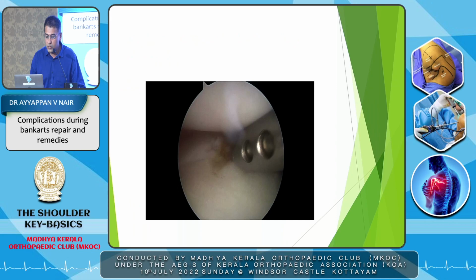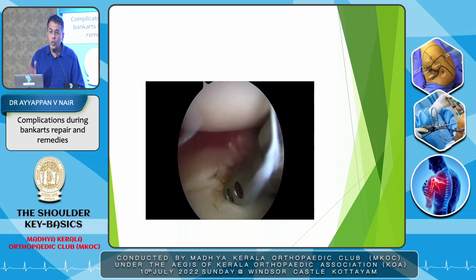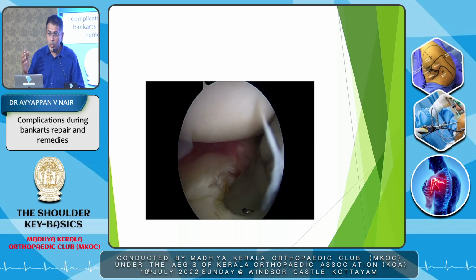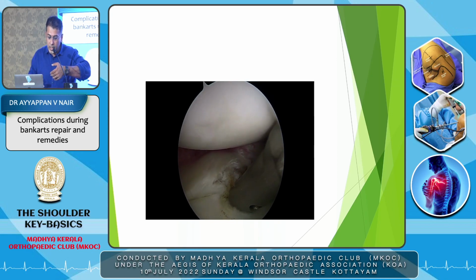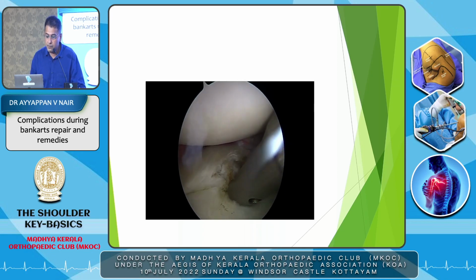So that is what I was trying to say. See, it will open up if there's no traction. You don't have to put a lot of weight there. It's a 6 o'clock position. With the anterosuperior port, a slight elevation, pull it posteriorly, and slightly lift up, and you can see that 6 o'clock coming in.